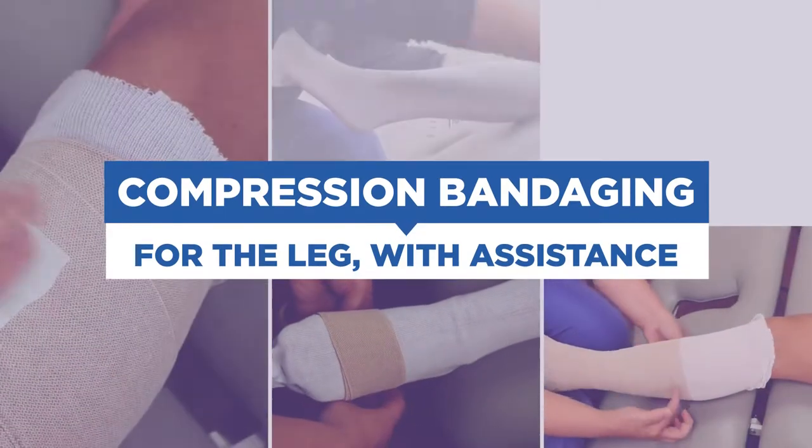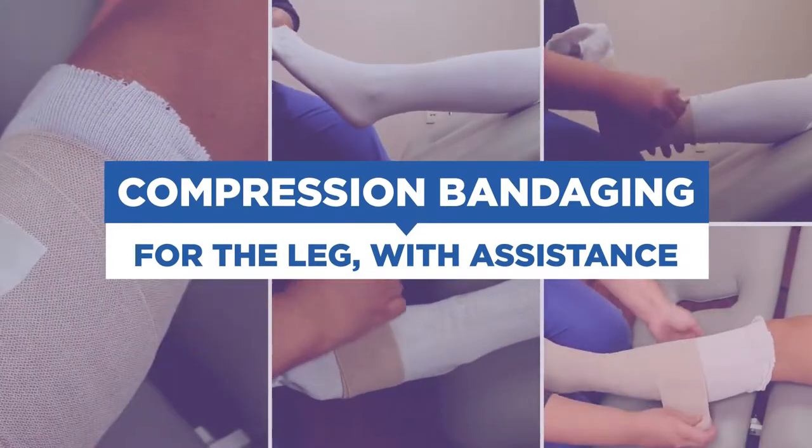Hello, I'm Paige, Physical Therapist at Spartanburg Regional. I'm about to show you compression bandaging for your leg when you have someone to help you.